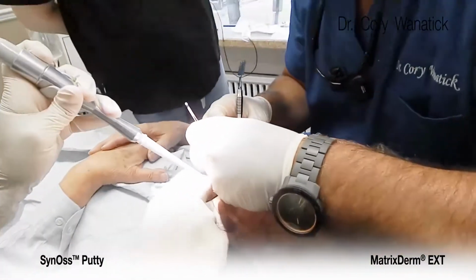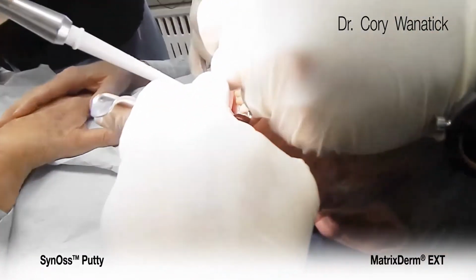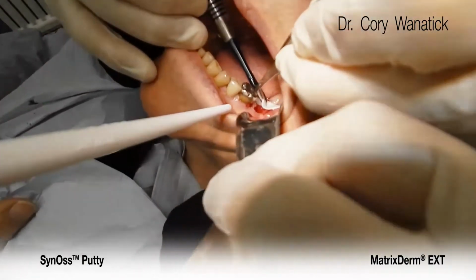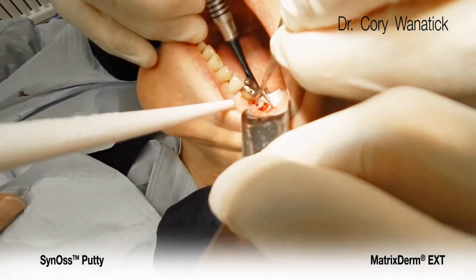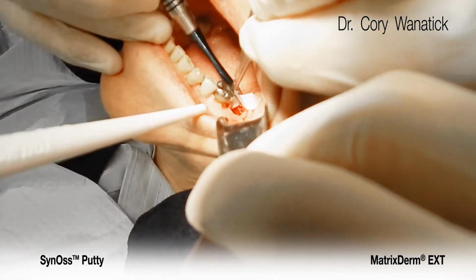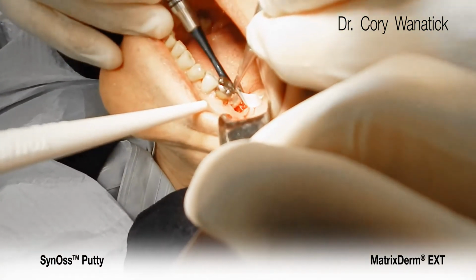Turn to your right. We're placing the membrane on the lingual aspect of socket number 18. We created a slight pouch for its placement.